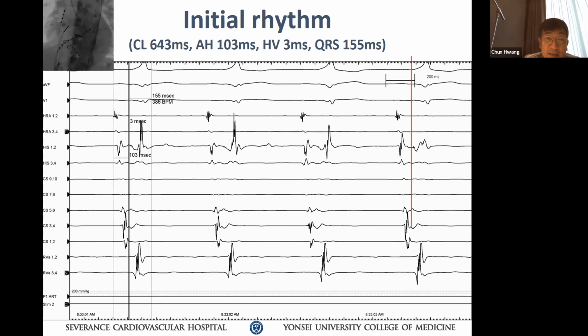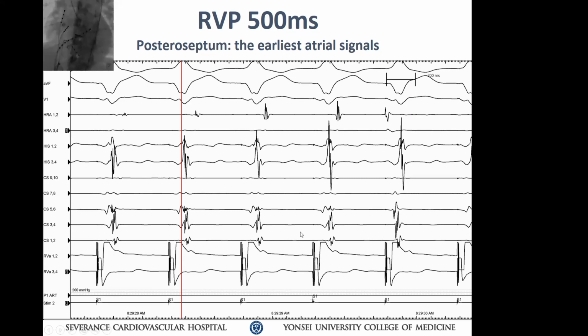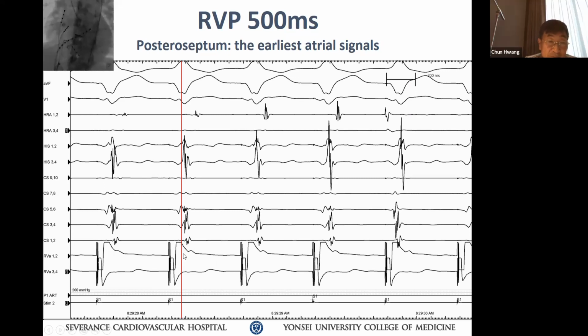If the delta wave is not measured carefully, it is going to mislead you. And then you have a presumptive diagnosis. Oh, this is going to be posteroseptal. No, don't get blind, okay? Always keep an open mind. Okay, let's go. How did it go? During the pacing, yes, retrograde A is still 5-6 early.